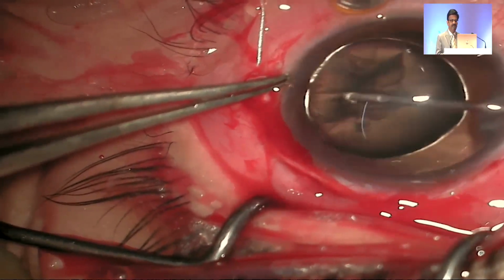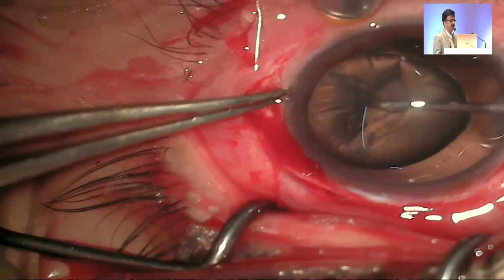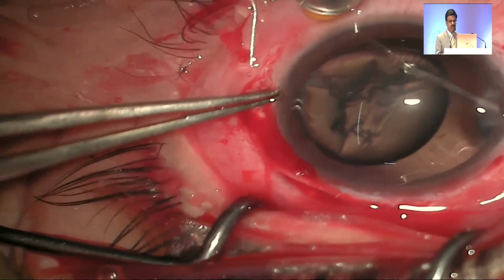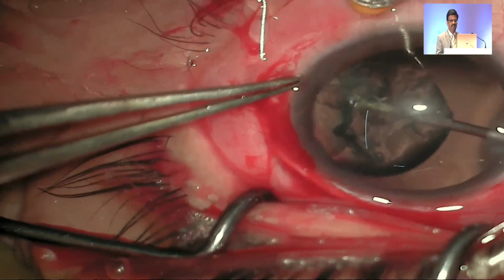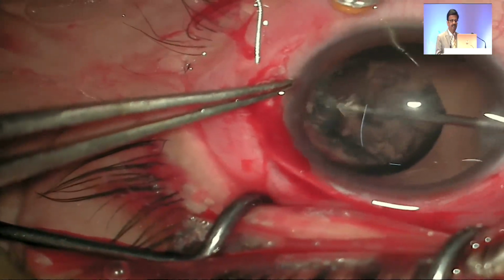So we did a lensectomy, and care has to be taken that cortical fibers don't fall into the vitreous cavity. First make an opening on the anterior capsule and anterior side of the lens, and then probably from the equator side we start removing the lens, and the attached portion of the lens is taken off last.